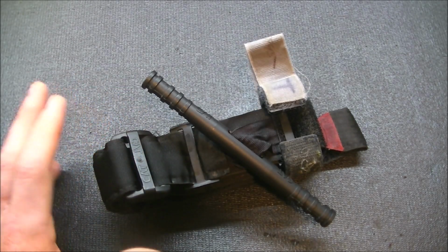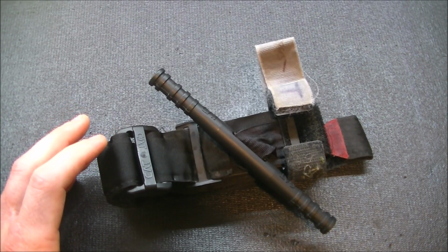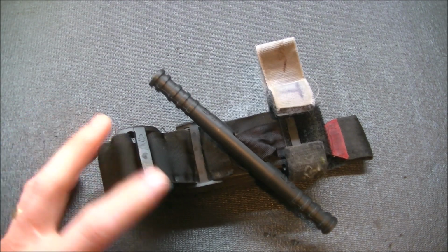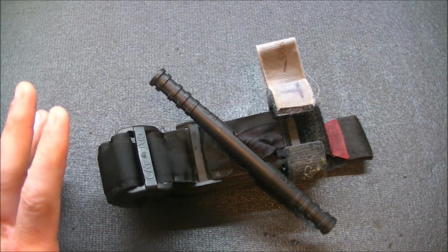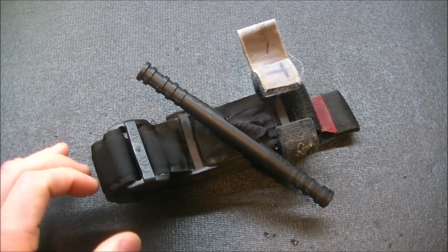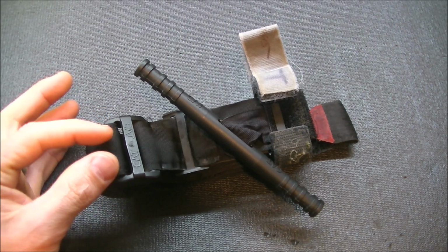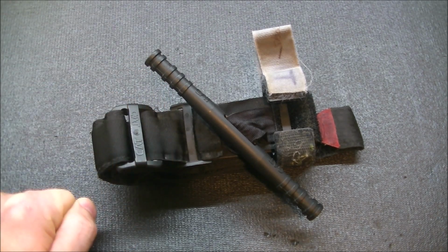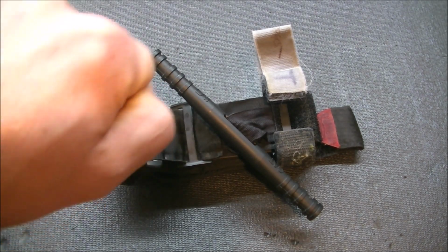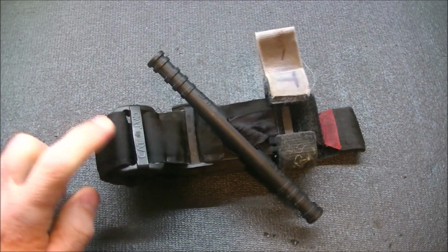However, there are some alternatives, and it basically is a cat tourniquet with an alteration to the metal or the Velcro strap. So that would be the SAM XT tourniquet, and I don't have one, but it's one that I was actually looking at getting to train with. But the SAM XT tourniquet has holes in the sides, then it uses Velcro and those holes. There's a little pressure block that has two little studs that pop out inwards, and when you tighten the strap down really hard, which is where you make your money on tourniquets, and that initial tie down is where all the money's made, it'll pop into place and lock the strap in place.